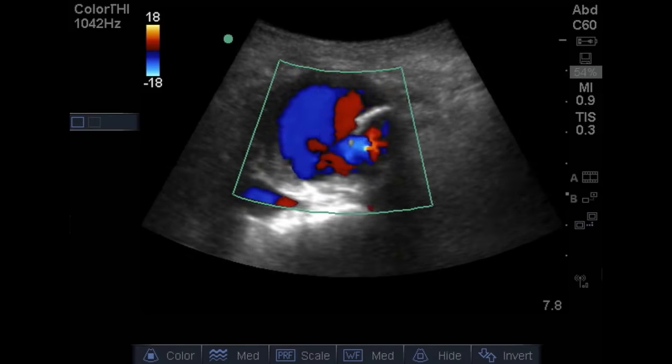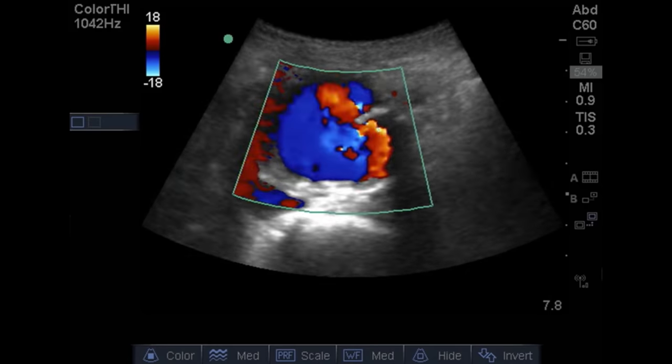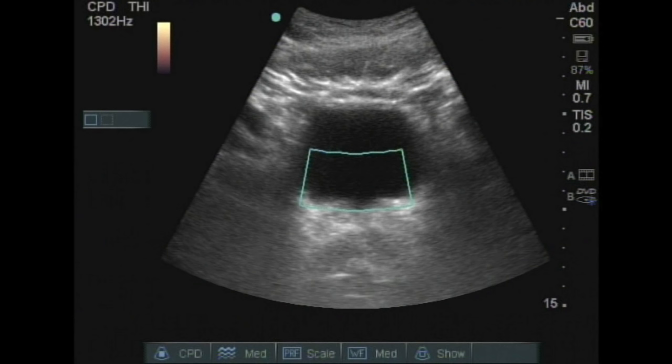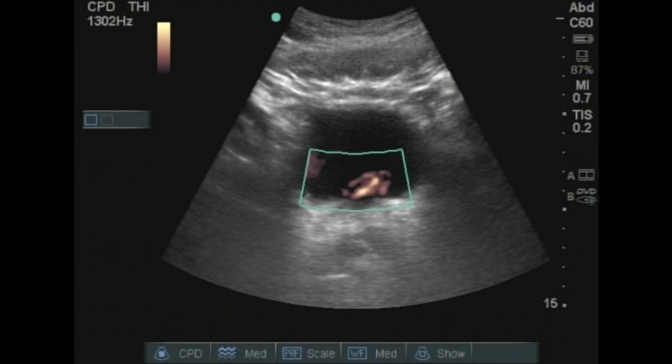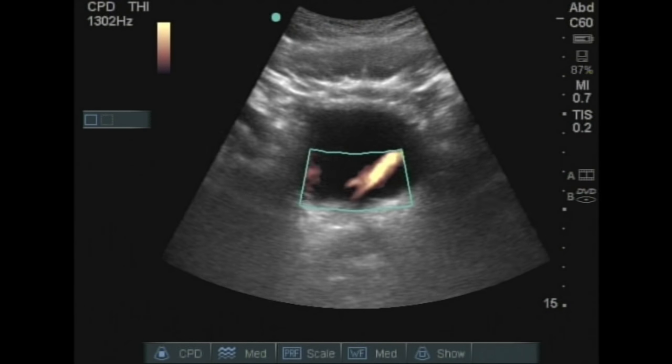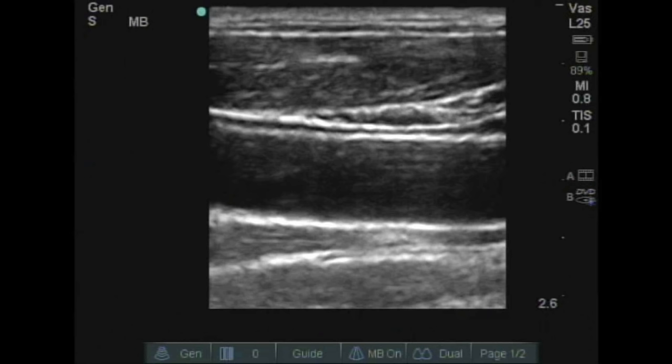Remember, color does not denote arterial or venous flow, but rather direction relative to the probe. By convention we try to make arteries appear red and veins blue, however this is merely by position. Power Doppler looks at the intensity of the reflectors rather than the actual frequency shift, and is useful for low-flow states such as small vessels or ureter jets within the bladder. Spectral Doppler looks at the velocity of reflectors through the gate and maps it in wave format with an audio component, since the frequency shift is within the audible range.